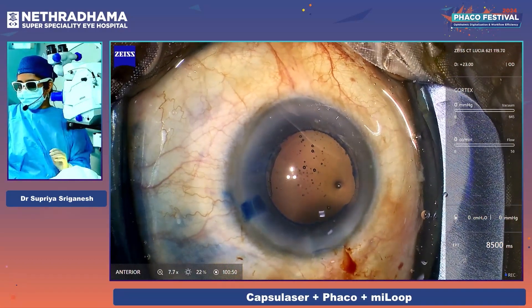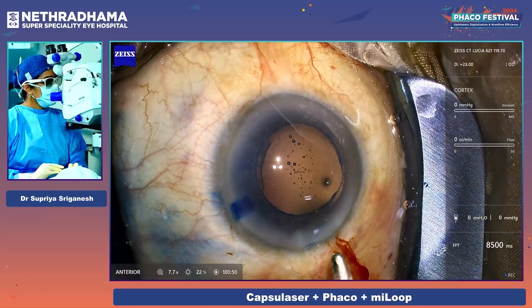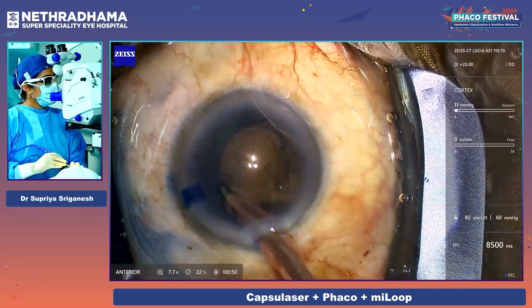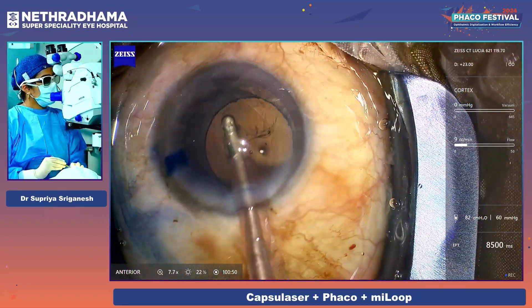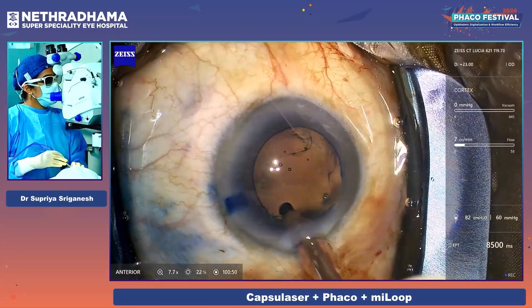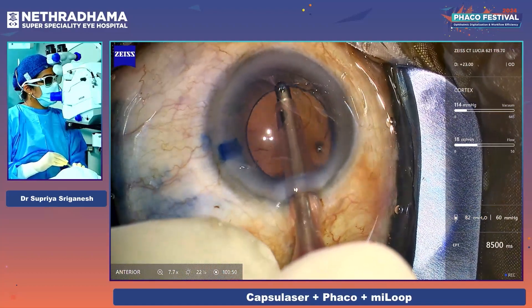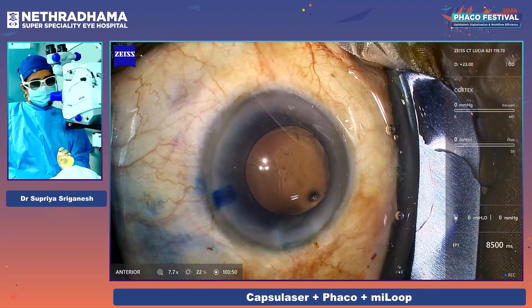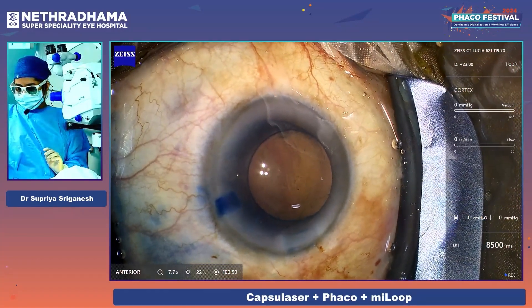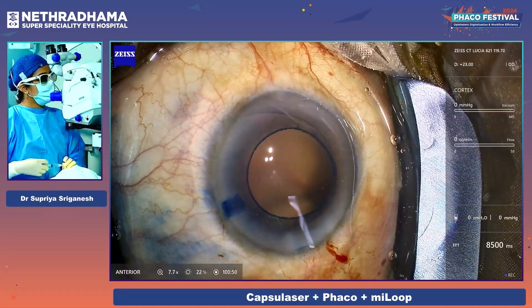As you can see, the positioning of the eye is very important while using this laser. Although it's slightly decentered, this will still do. The cataract was easily removed and it's quite a strong capsulorhexis margin. I'm just doing the cortical wash. I like to use a coaxial IA. Just doing a hydropolish to clean up any residual fibers on the posterior capsule. It looks clean. I'm using the Zeiss CT Lucia lens which we use regularly — we've done hundreds of cases on the CT Lucia.